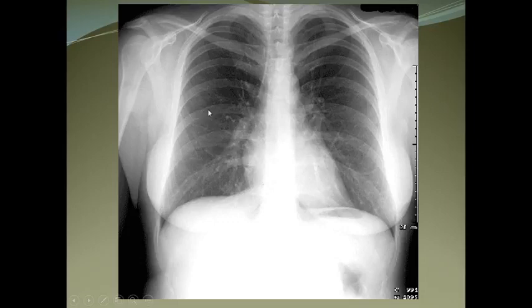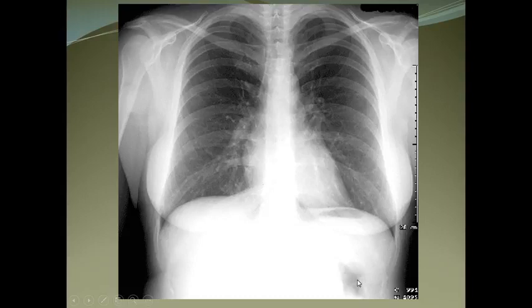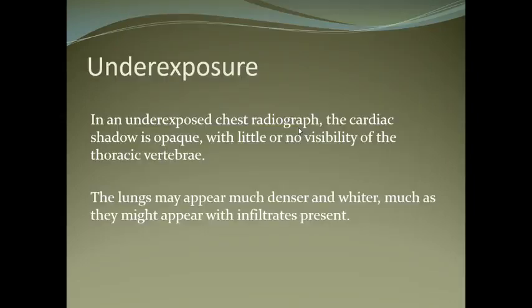These are the posterior ribs and the anterior ribs, which are obliquely placed. This is the stomach gas shadow, which is normal. This is the shadow of the pulmonary trunk and the right branch of the pulmonary artery.